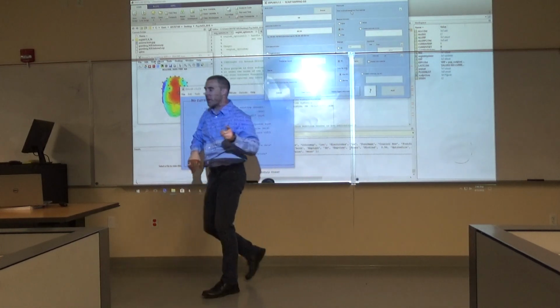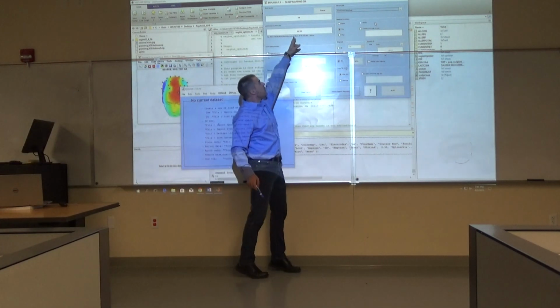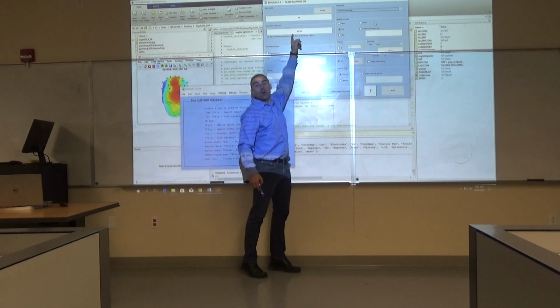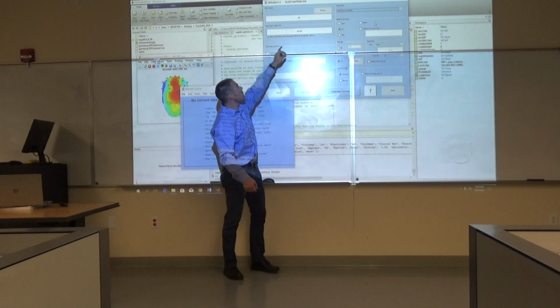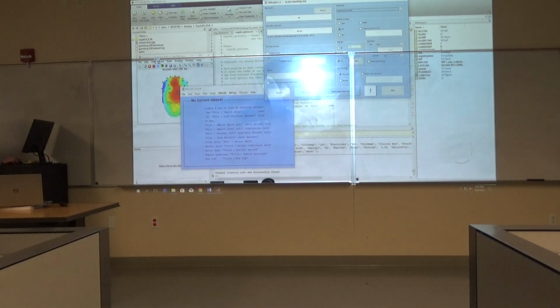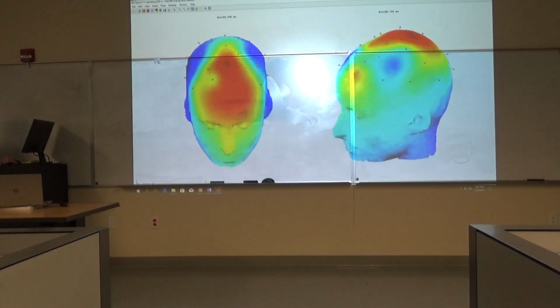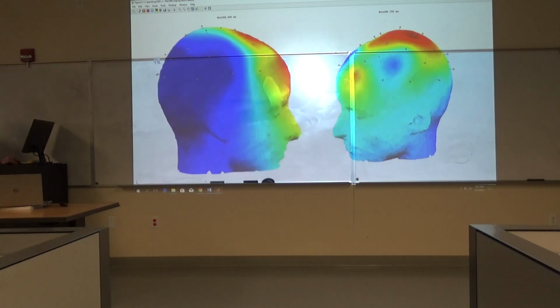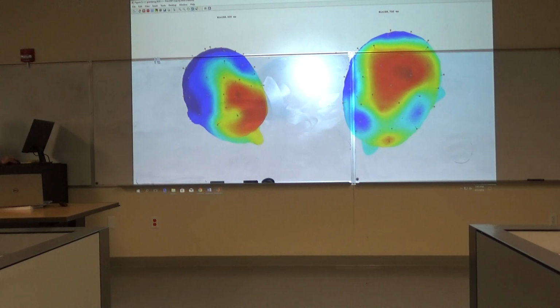Let's change that parameter now to not be the average. Let's just have it be the instantaneous amplitude, the first one. Before, we were taking the average between these 2 points in time. Now we just want the instantaneous plot at 1 point. But we happen to give it 2 points. Which means, if all things work, that we'll be able to plot 2 at once. And you can face them off. And you can see these are different points in time.